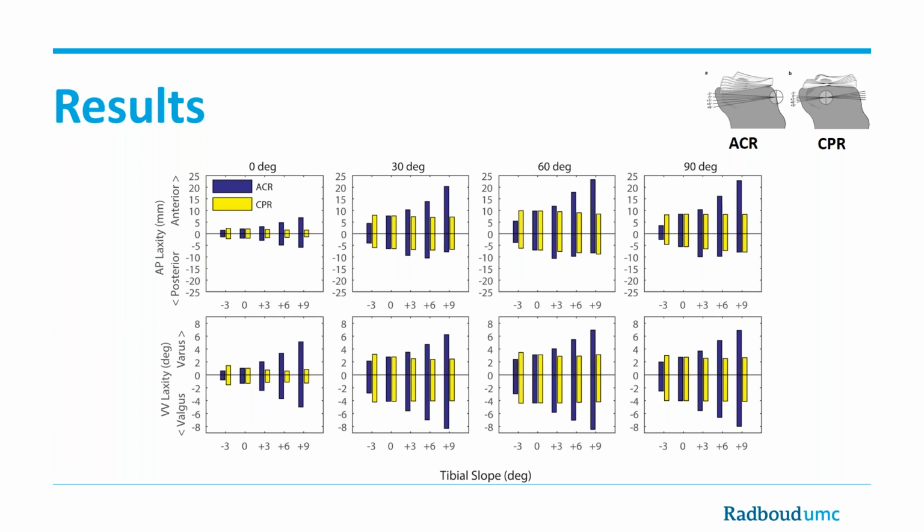What is different with the CPR technique is that generally the amount of laxity in the tibiofemoral joint is preserved to a very large extent. Therefore, tibial slope has less influence on the laxity, which we think would lead to a more stable reconstruction.